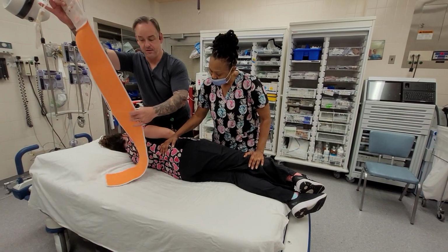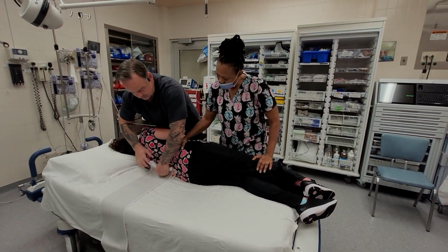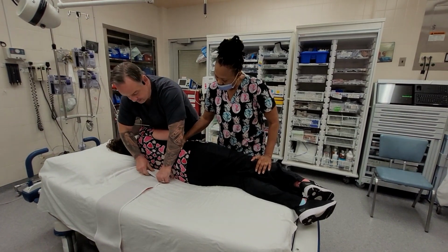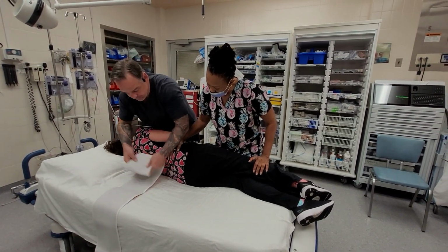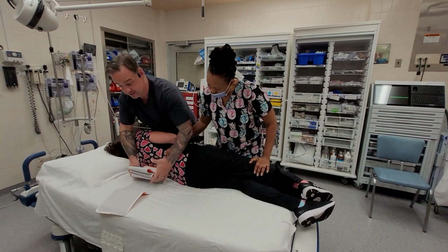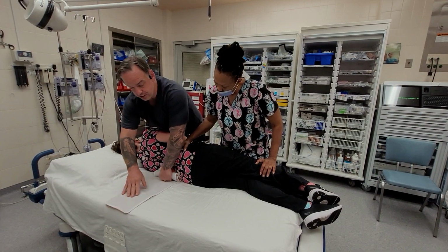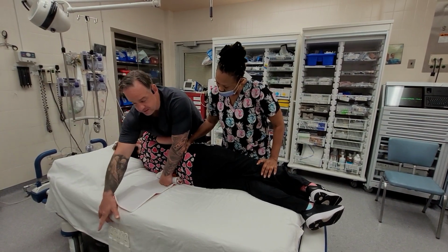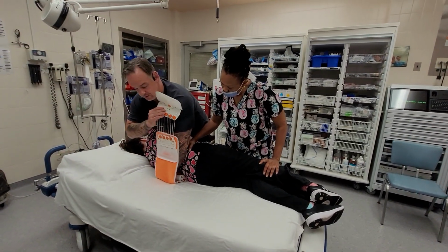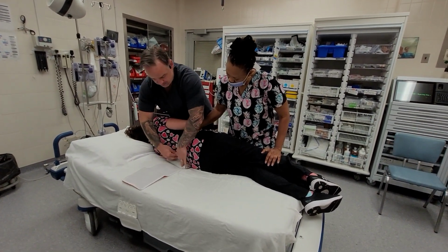The pelvic binder, okay? So you basically put it under the patient. You can sort of stuff it in there if you want, or you can accordion, sort of fold it until it's the right length, because it's actually quite long. It's designed for multi-sized patients. And you want the edge of your device here, which is already on there, you want the edge of the device to be sort of close to the edge of the bed as much as possible.